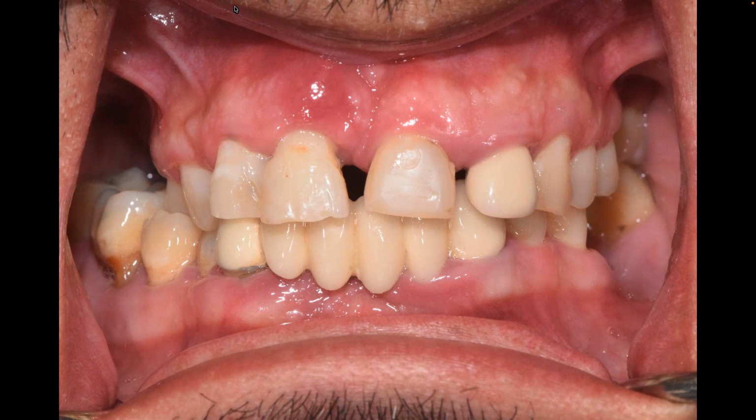Now, you see where that is? In this patient, please take my word for it because you can't see the patient's face, but the facial midline actually coincides with the labial frenum, which you can see in this picture. You see how the incisal embrasure between 24 and 25 does not coincide with the frenum.